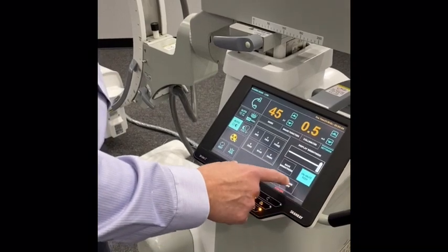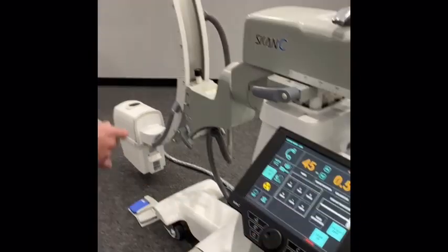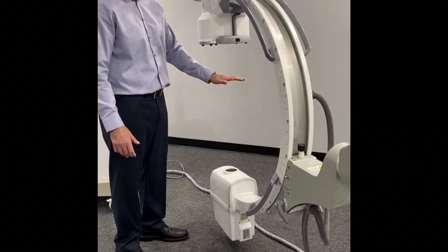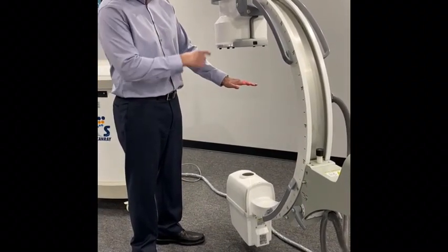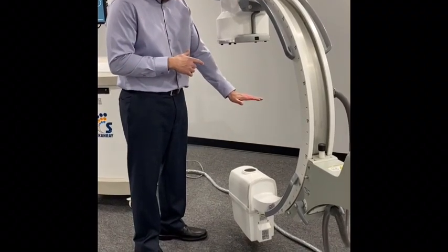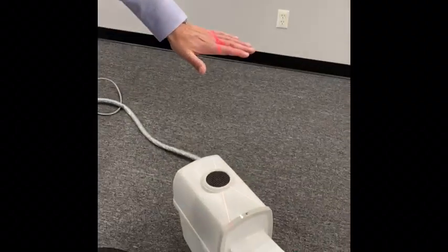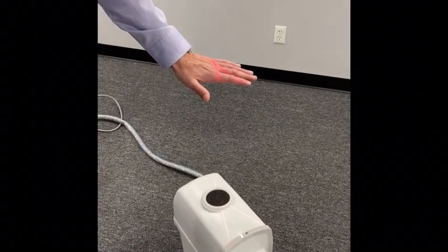I'm going to quickly show you the laser function. You can turn the laser on and come over here. Most C-arms have class 1 lasers, but this is actually a class 2. When you have operating lights on and it's a very bright environment, a class 2 is going to produce a very definitive laser on the body so you can see exactly where it's at. It's a really nice feature having a class 2 laser on this system.